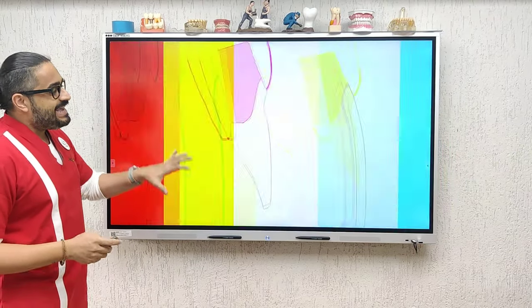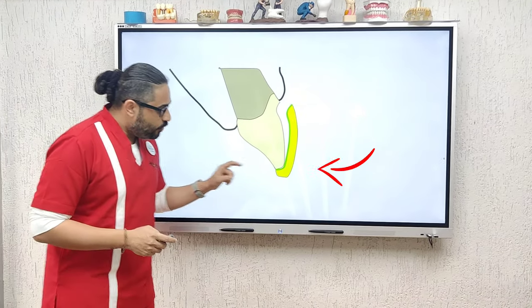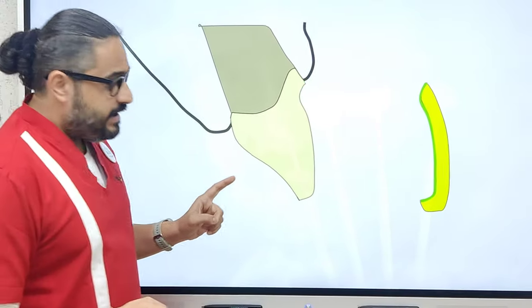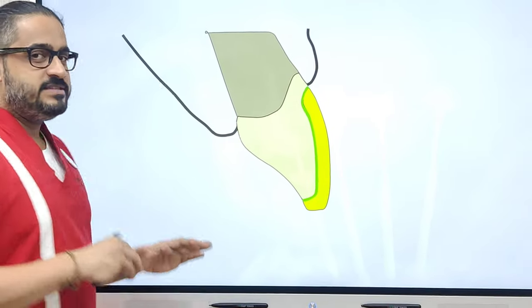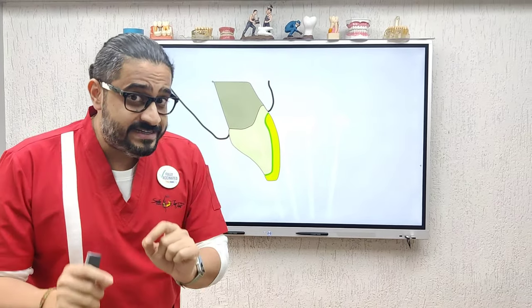Now take the prosthesis to the tooth in a very specific manner. Always adapt it on the incisal edge first and then rotate it onto the cervical. Adapt it on the incisal and then rotate the veneer onto the cervical, so all the excess comes out from the cervical margin. There is flash but there are no voids inside.